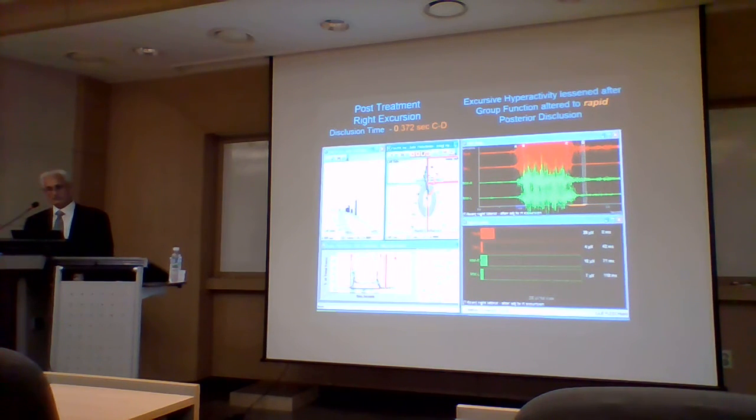컨택이 일어나고 있는 오른쪽 전체 쪽으로 이제 중심점 이동하는 걸 바로 볼 수가 있고, 이미지를 보면 And then the muscle activity after C is greatly reduced. 저건 이제 우리 렐러티브 값이 아니라고 했잖아요. 알다 보니까 전압값하고 바로 비교가 되는데 확 줄어든 모습을 볼 수 있어요. Remember, C is where the excursion begins. That's what you can see here in the EMG. 네, 오픈하면서 EMG에서 연동돼가지고 확 줄어든 걸 보여줄 수가 있습니다.